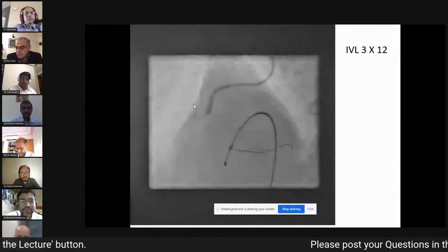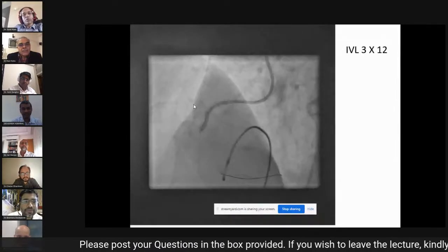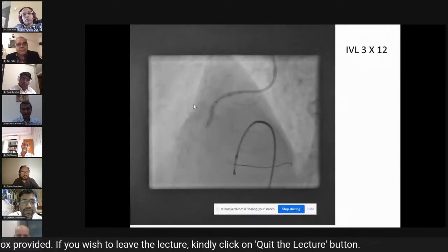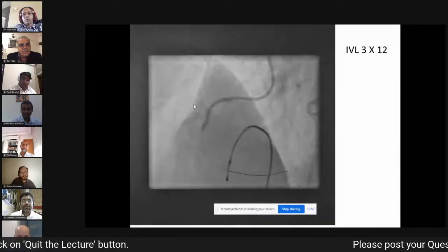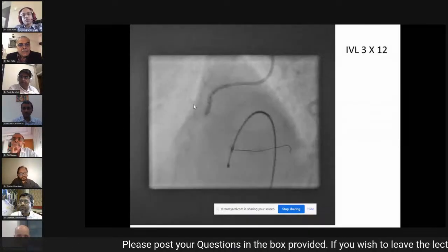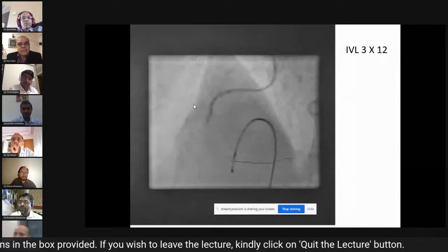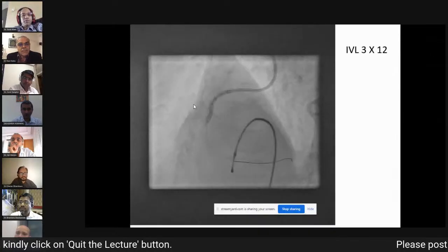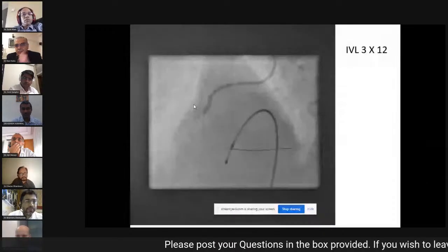Points very well taken, sir. We actually tried with OCT two times before this picture. We were a little reluctant this time because he already had one event in the interim period. So we thought we would first better prepare the lesion and then think about the imaging. That was one reason for not doing OCT through the Guidezilla. And for rota, sir, we reviewed some articles. They show a lot of heat generation with previous stents and probably poorer long-term outcomes. Of course, debulking is something we definitely thought of, but because of the concerns, we avoided that.